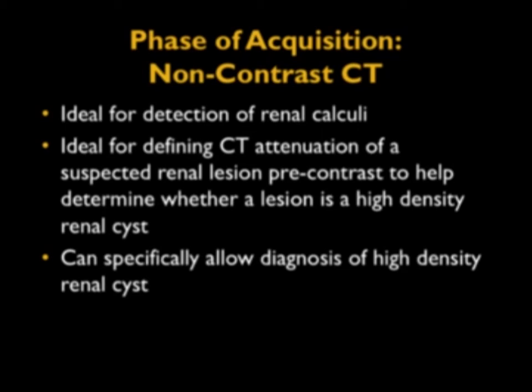It's important to recognize also what a non-contrast study means. I said before, if you have a patient who has hematuria and the non-contrast study is negative, it means there's no stone. It doesn't mean the kidneys are normal and the study shows no pathology.